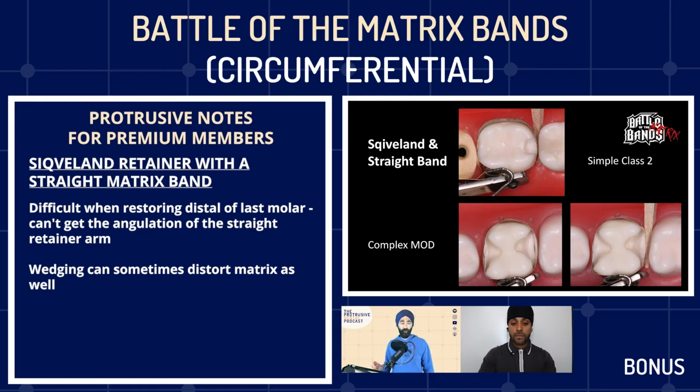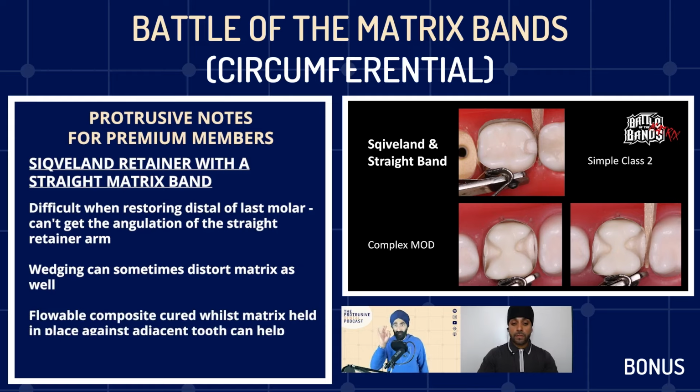A thing I was taught, which has worked wonders for me, and I believe it's evidence-based as well, because this Swiss dentist was up on the podium, very much evidence-based, going through all the stuff. It's a technique where you squirt a little bit of flowable at the base, where the matrix meets the cavity, and then you put your probe into the flowable, lean that probe against the adjacent tooth, and then you flash cure it.